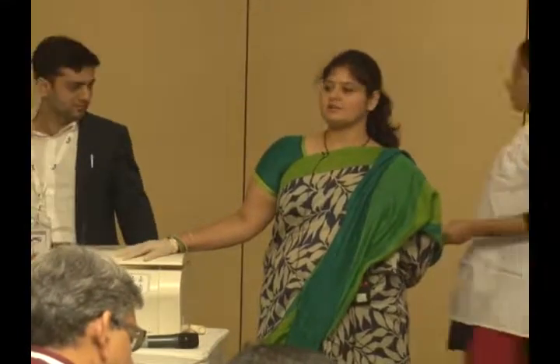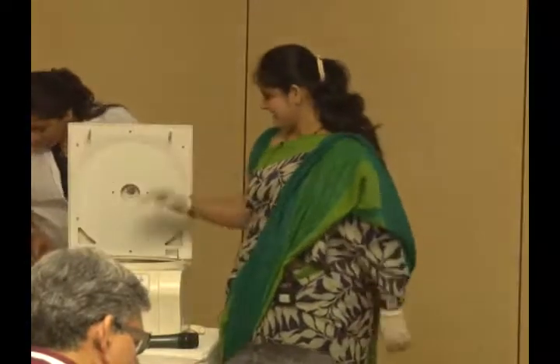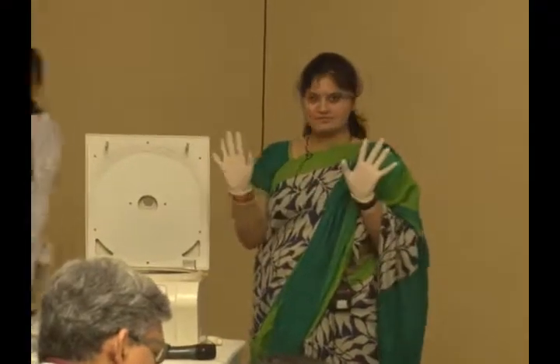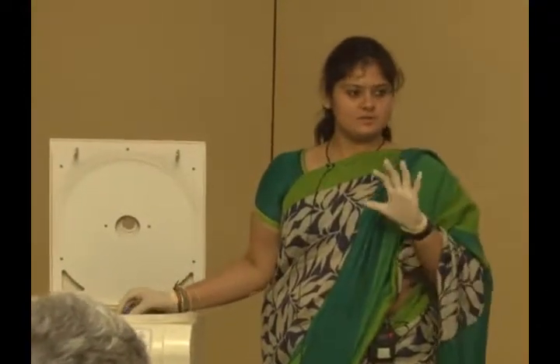Shall we move to the procedure? You all remember what we did before the lecture? Now I am removing the tube from the centrifuge after 20 minutes. What we get is a pellet of the motile sperms.